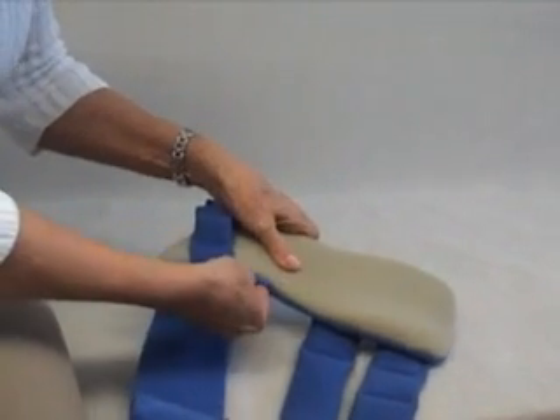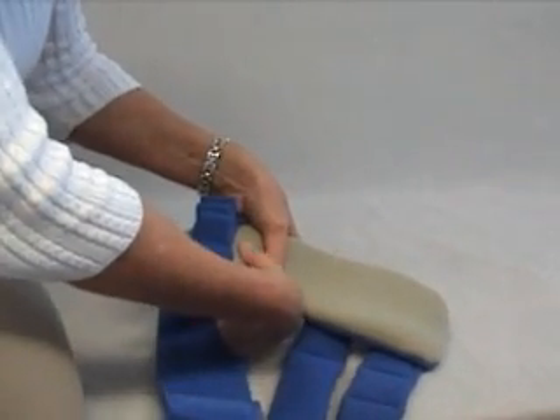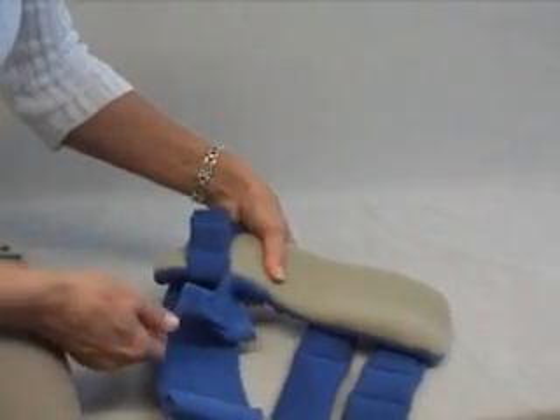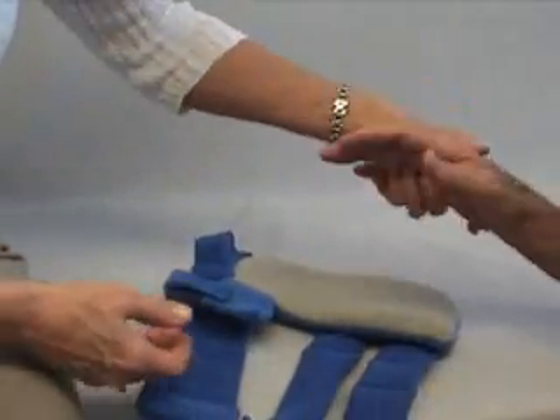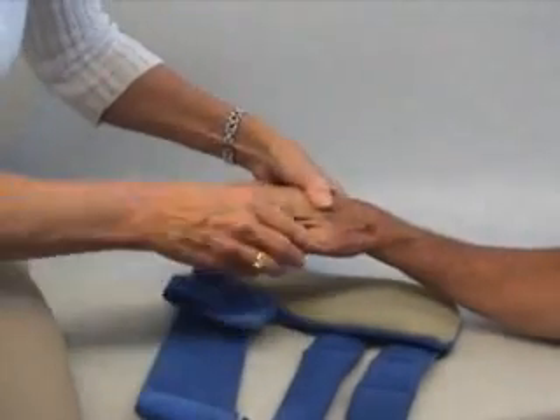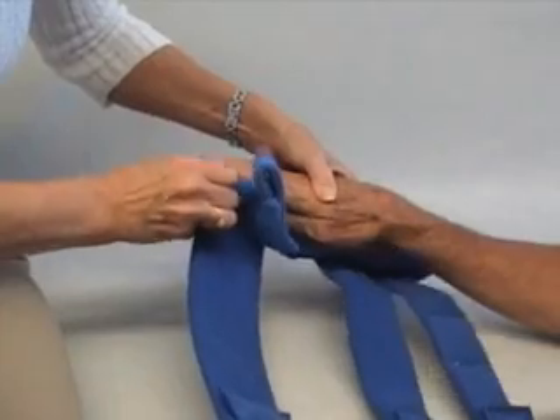You simply slide it on your patient's thumb — slide the thumb and fingers in so it's as easy as possible. The way you would fit it, you would have a tight thumb and you would slide it in.